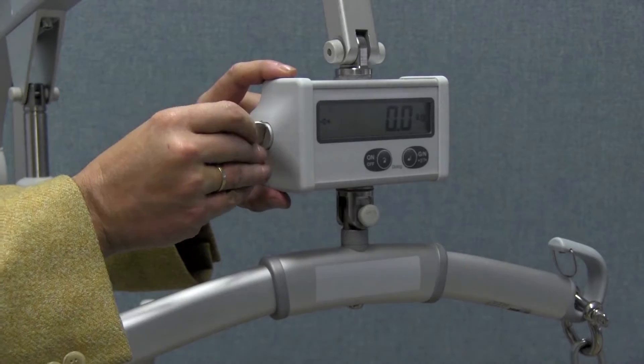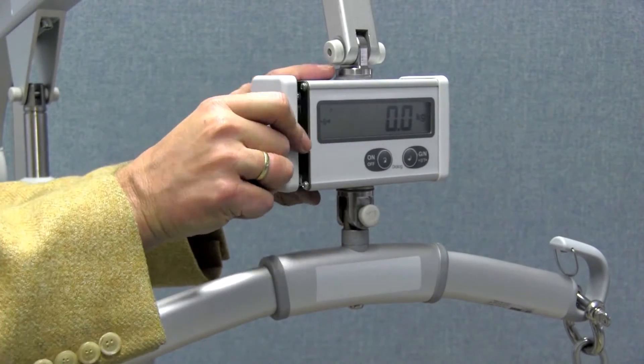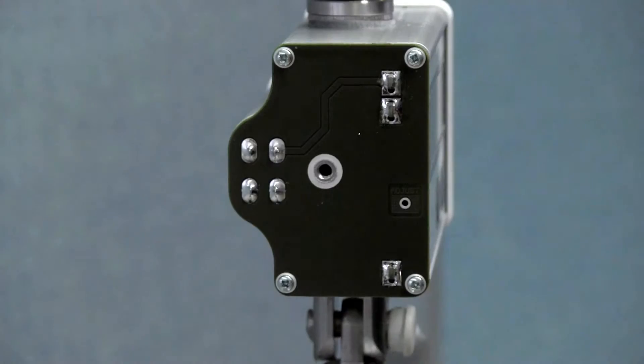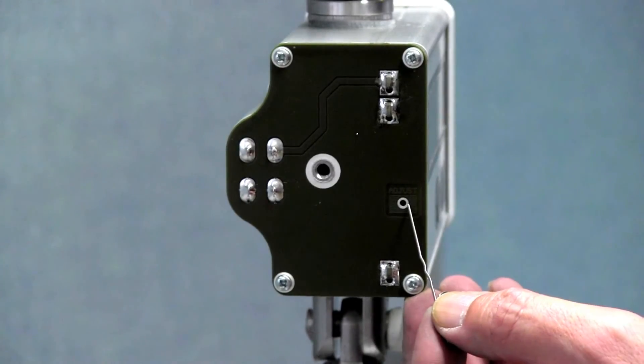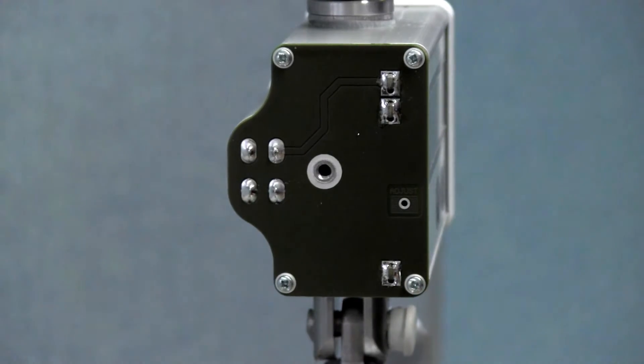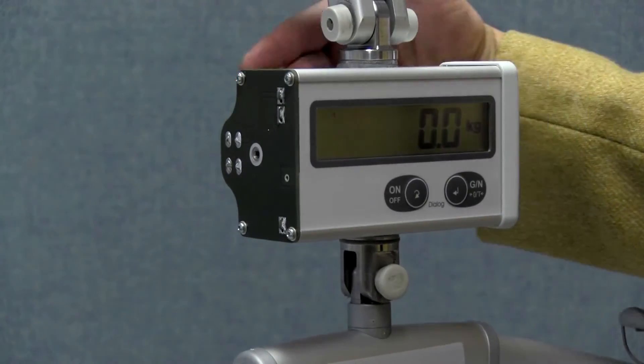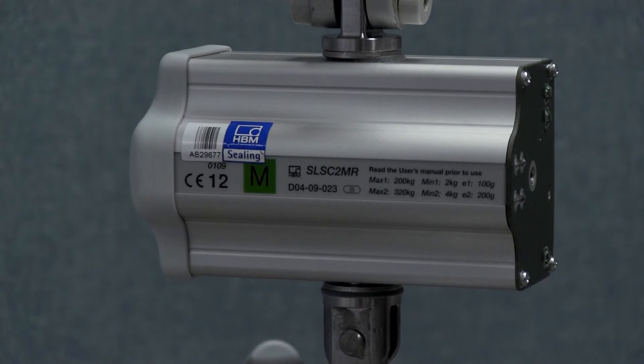Now I will use the coin to unscrew the side cap of the sling scale. You can see the hidden button which has to be pressed to make the setting. We can also see the parameters that have to be set on the back of the scale.